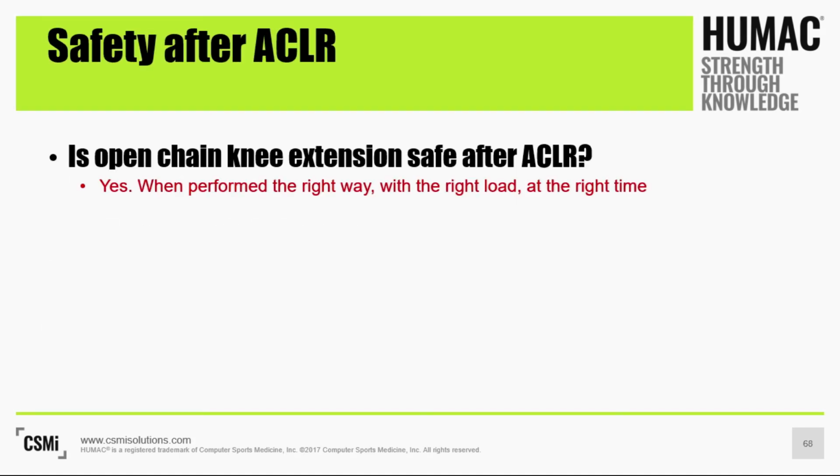One last discussion point in this module before we move on is that I get asked all the time whether open chain knee extension is safe to perform after ACL reconstruction. And the answer is yes, it is safe when it's done at the right time, when it's done with the appropriate setup, and when you limit the torque load.